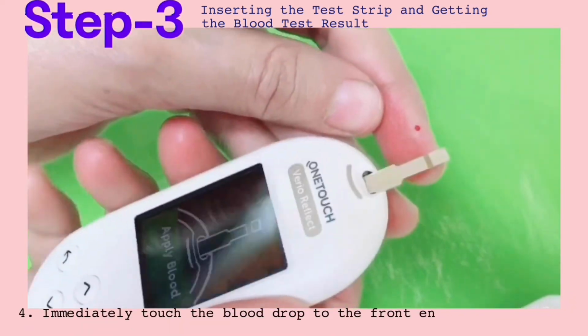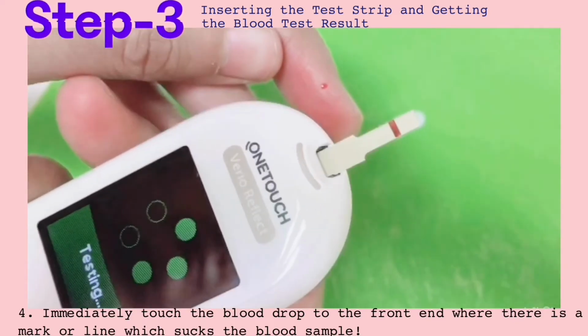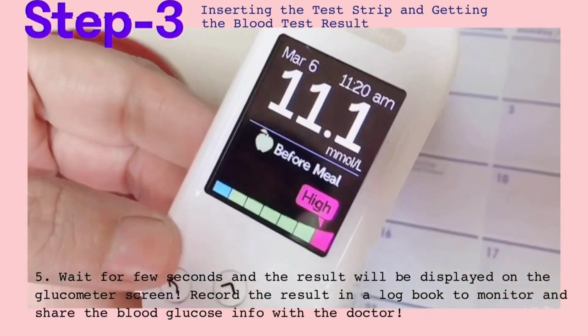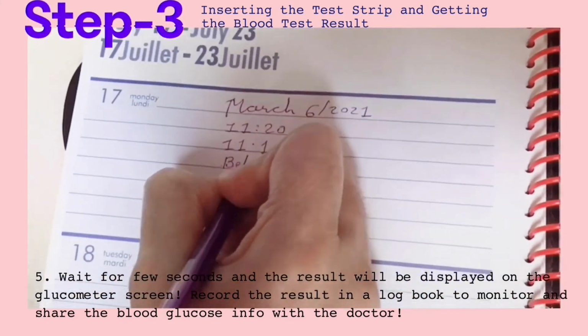Immediately touch the blood drop to the front end of the test strip where there is a mark or a line which sucks or absorbs the blood sample. So wait for a few seconds and result will be displayed on the glucometer screen. Record the result in a logbook to monitor and share the blood glucose info with the doctor.